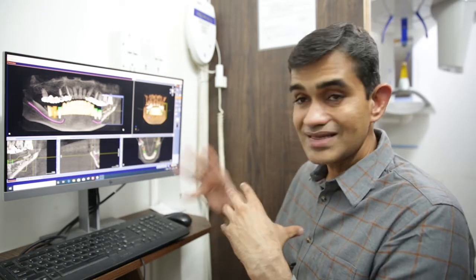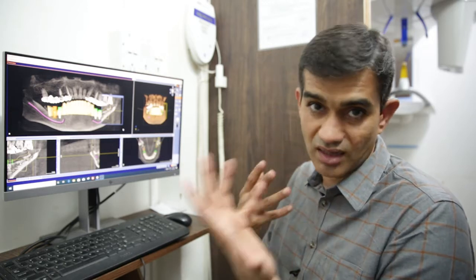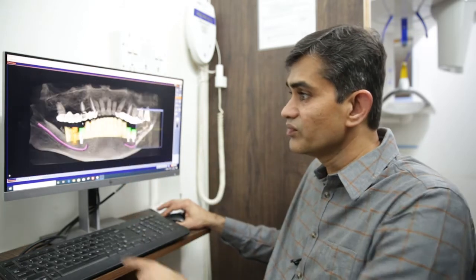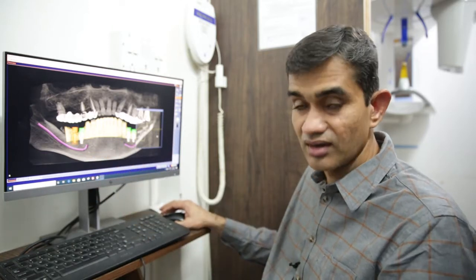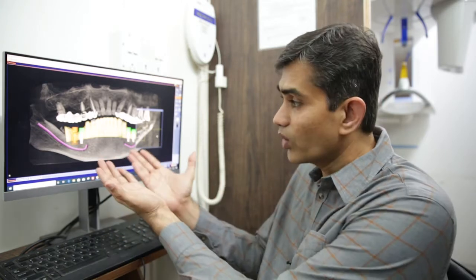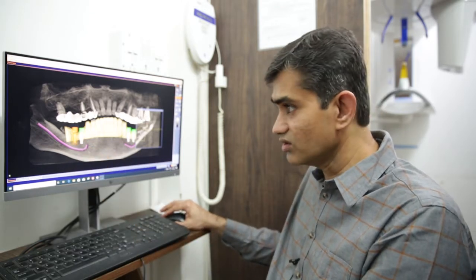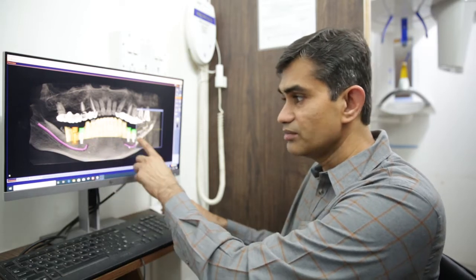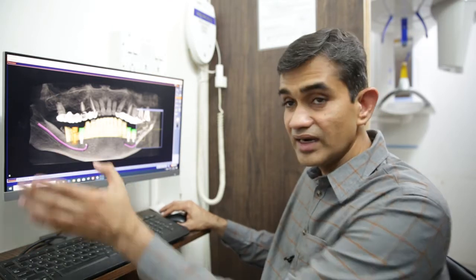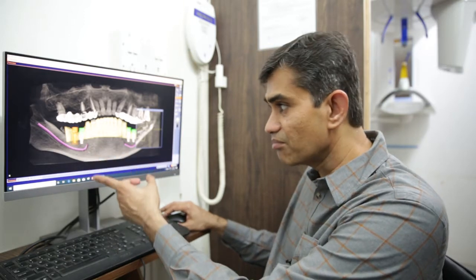Now we know how good the bone is and how we can plan the implant. The second part is taking a digital scan of the patient's gums and jaws and forming a model. The yellow color here is the actual patient jaw model. That patient jaw model and the CT model are then integrated into one unit.